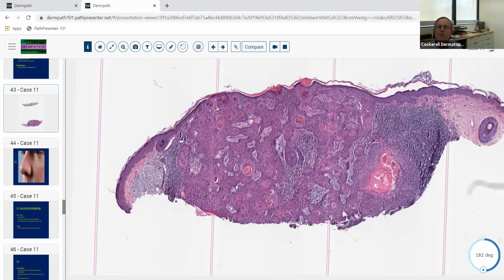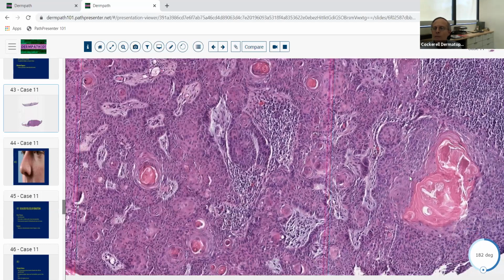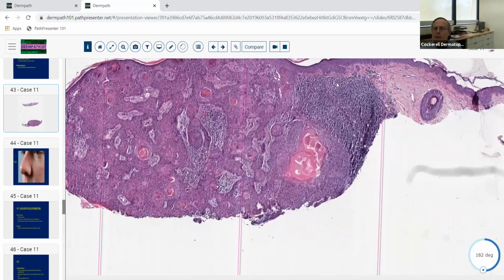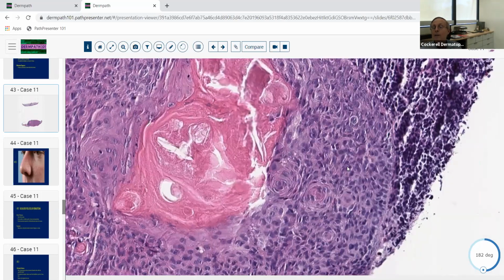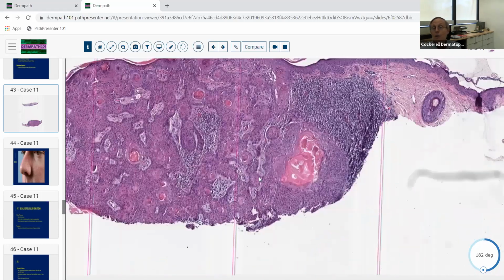The architecture looks like a wart, and you see the squamous eddies. Think of inverted follicular keratosis. If it looks like a wart, but it's got more of the outer root sheath of the follicle, tricholemmal differentiation, this kind of thing over here, then you might think it's more a generalized tricholemmal verruca, if you will. But still, it's benign. I'm not sure this is a verruca.